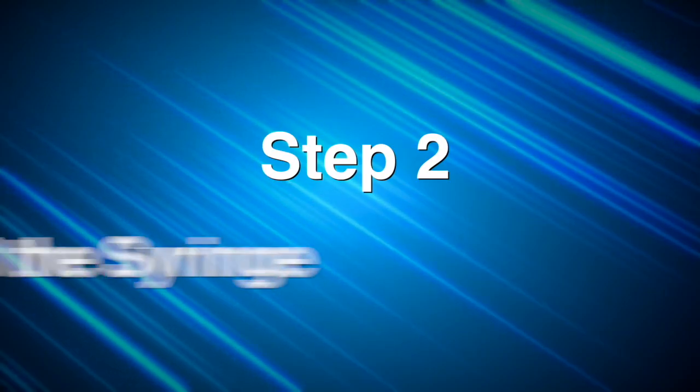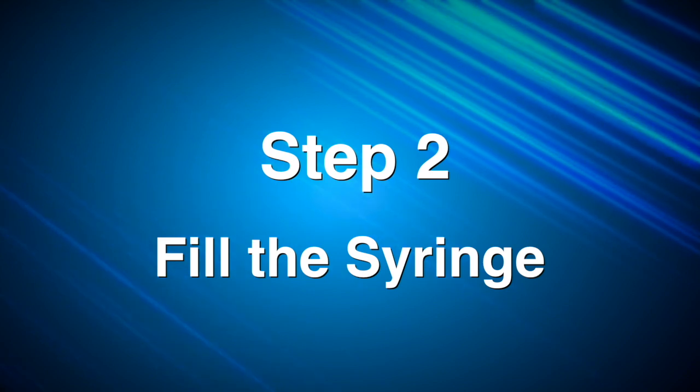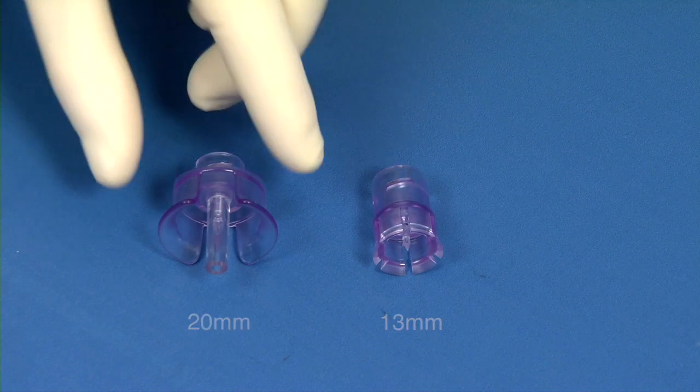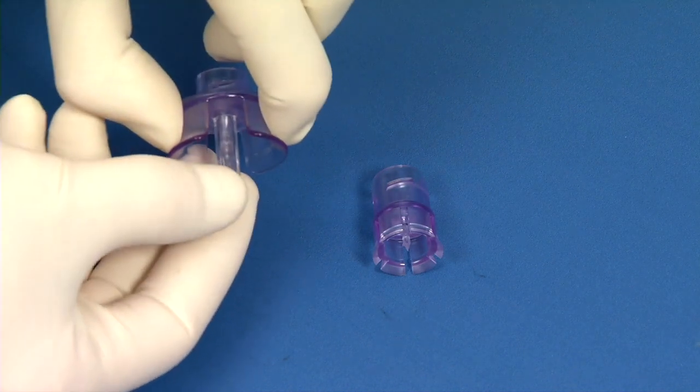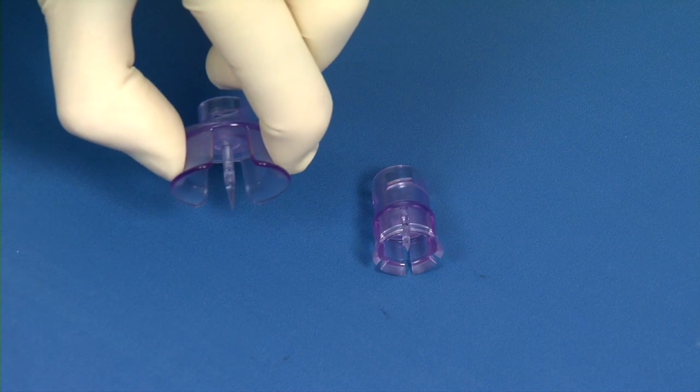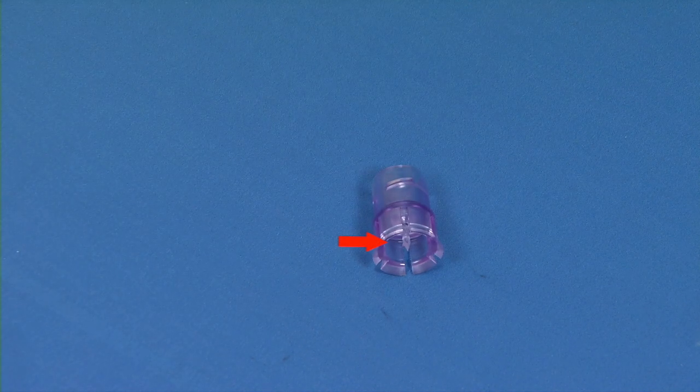Step 2. Fill the syringe. There are two vial adapter options: the larger 20 mm universal adapter and the smaller 13 mm. When using the 20 mm vial adapter, remove the protective sleeve from the spike. The spike is recessed on the 13 mm vial adapter, so there is no protective sleeve.